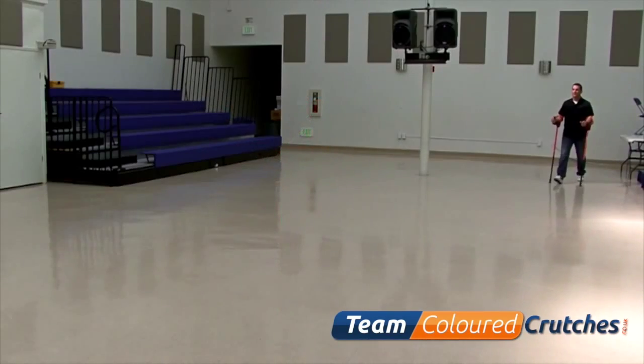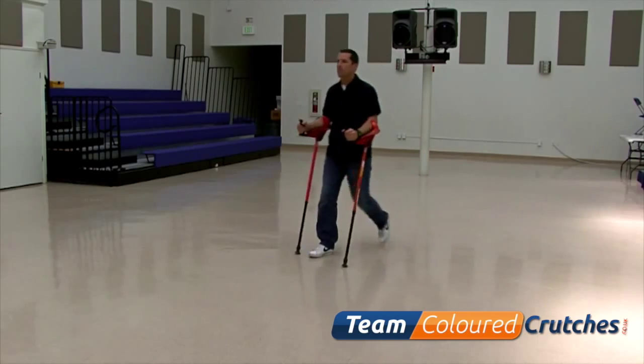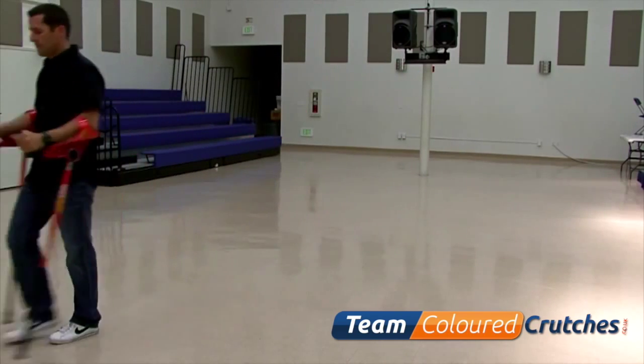If you are using smart crutch for weight bearing, or what we call assisted walking, you can immediately select an angle setting to meet your personal requirements.